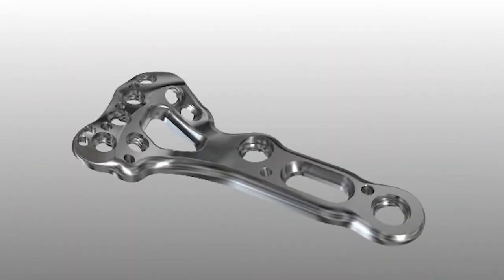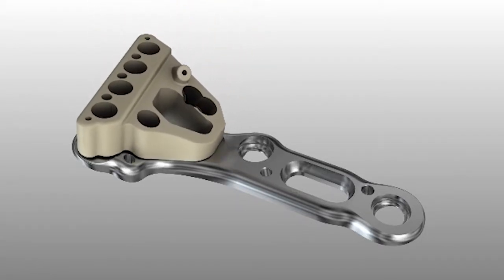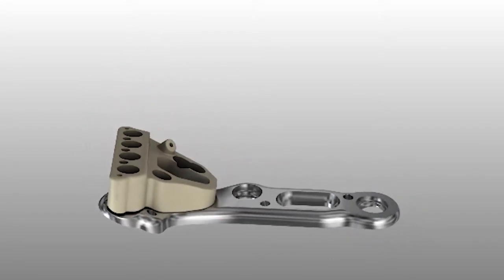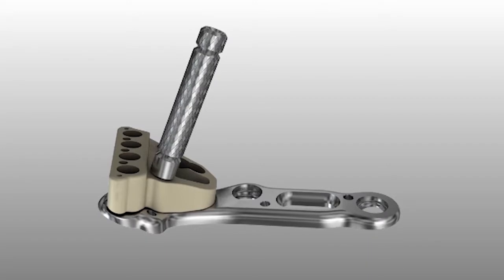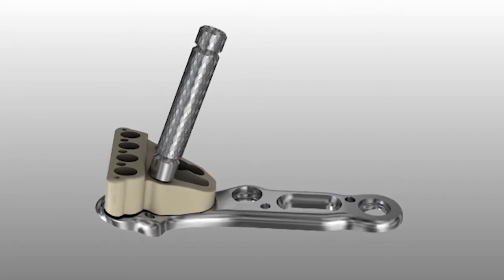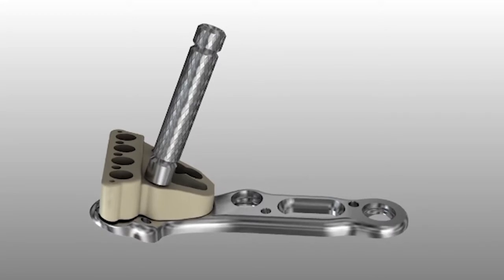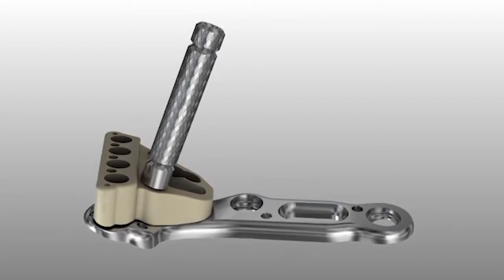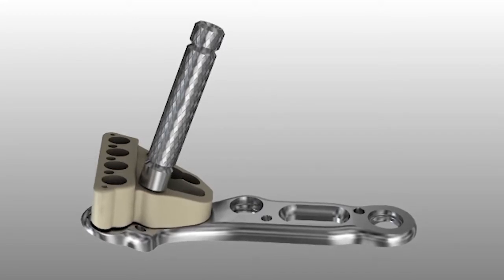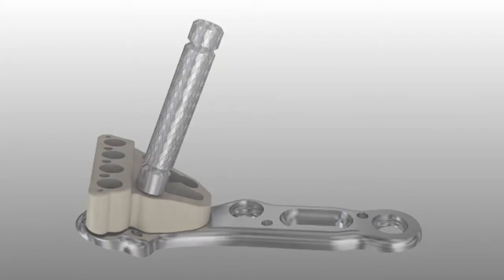Once the appropriately sized VDR plate is selected, attach the corresponding targeting guide to the plate by threading the cannulated locking bolt into the proximal ulnar 2.3 mm screw hole. The locking bolt can be inserted into multiple distal screw holes through the targeting guide. It is recommended to utilize the proximal ulnar screw hole, as that is typically an optional hole for screw placement. This may be done on the back table prior to insertion.